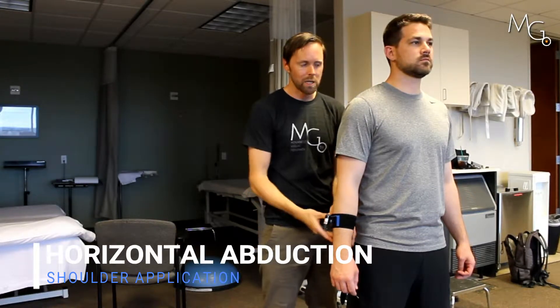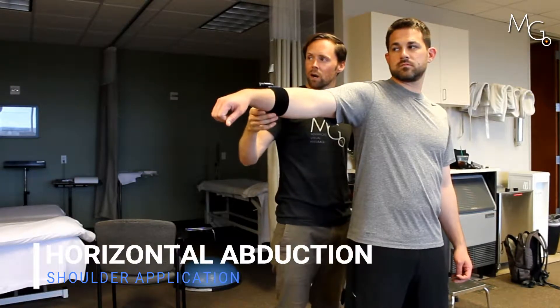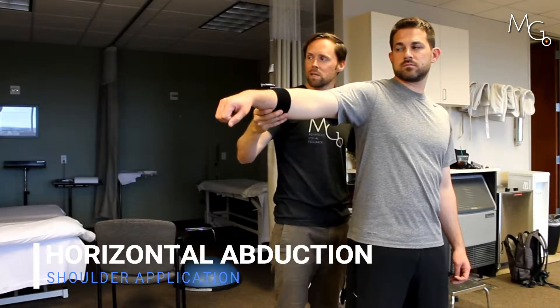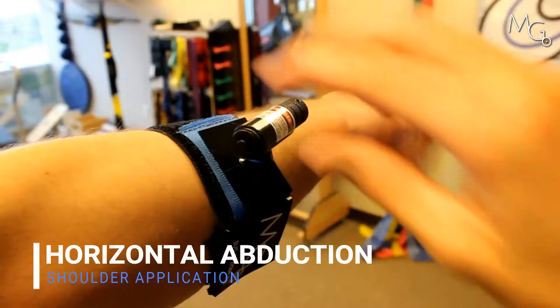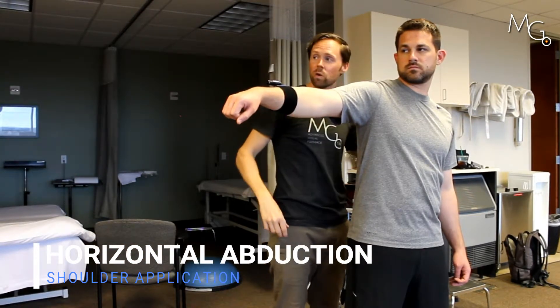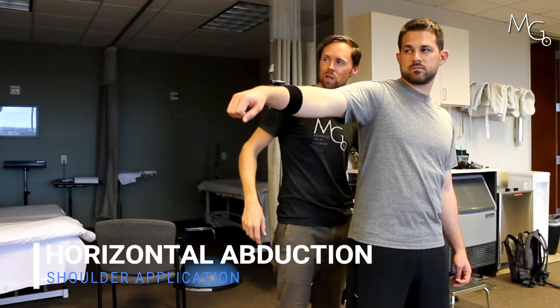I'm going to turn on the laser. Chris, just bring that on up and center it to target — you can look at it. Here, what I can do is if he is centered but I want him to be into a little more horizontal extension, instead of having to move his arm back, I'm going to rotate the ball on the ball and socket joint forwards, and then say, I want you to reposition that. Good. And then go back to where you were, and just do that a few times.